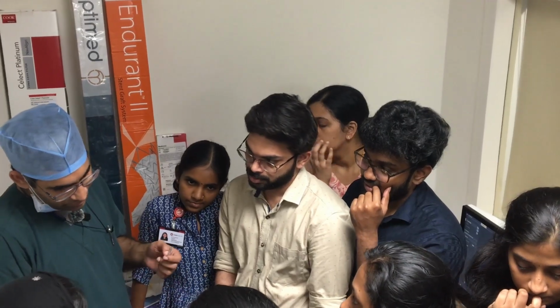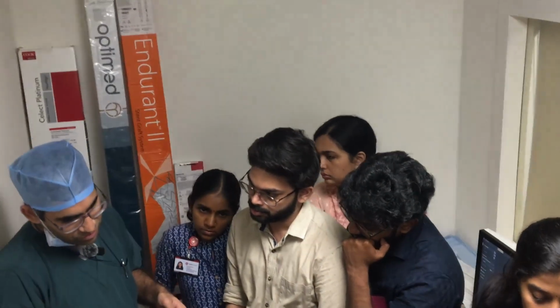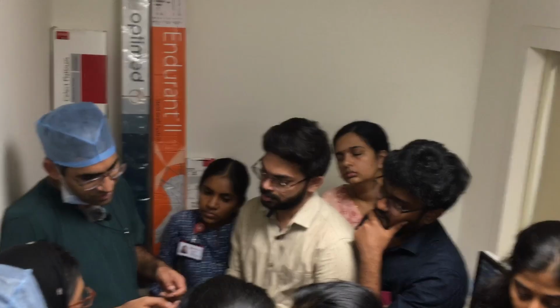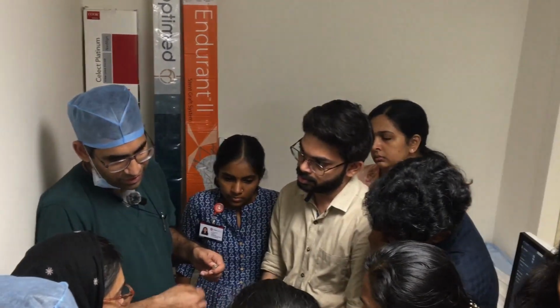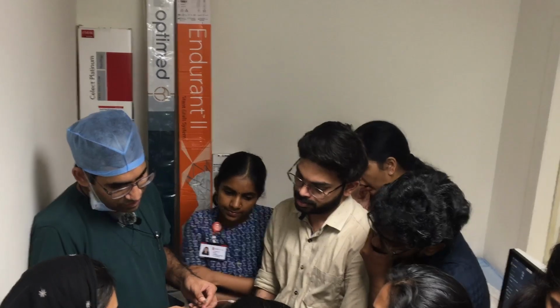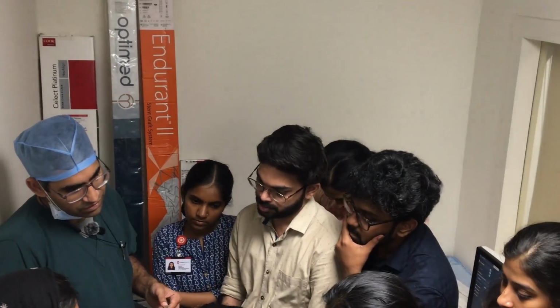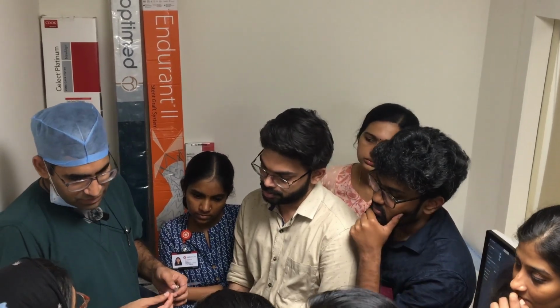Yeah, if you have to use it or do the procedure with the over the wire type, you need a longer wire, 300 centimeter wire at least. Because once you use this balloon, you have to take it out to take the next device, then exchanging and all these things, so it makes the procedure a little longer. A rapid exchange makes it faster.